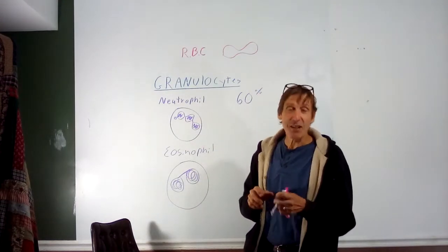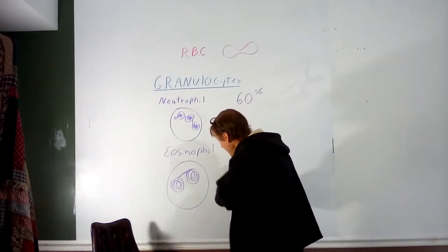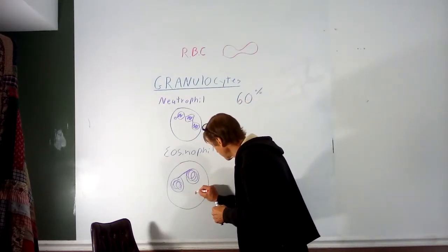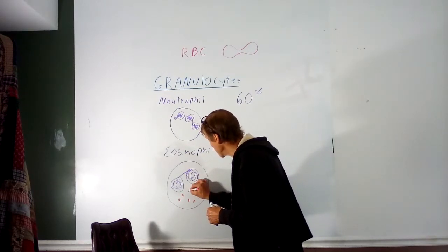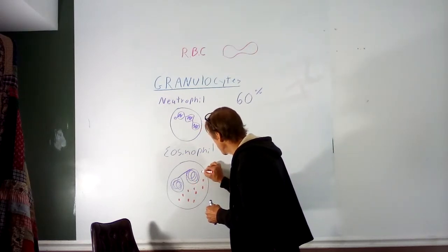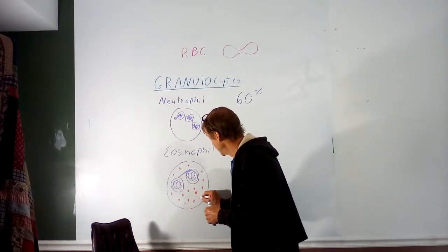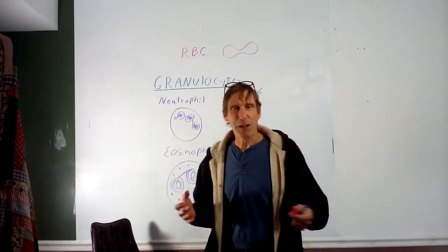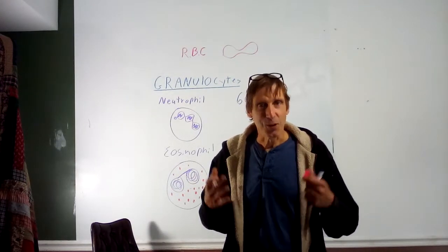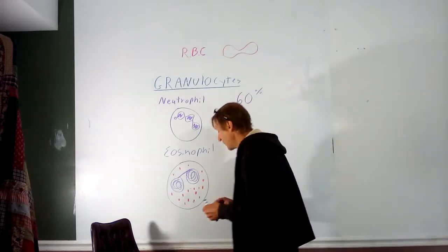And what usually makes these really distinctive is the cytoplasmic granules. They have very obvious, very large, depending on the prep, pinkish, orangish, or often reddish dots in the cytoplasm. The eosine stain is a reddish, yellowish, pinkish stain. That's why they're called eosinophils. The granules have an affinity for this pinkish stain. So those are eosinophils.